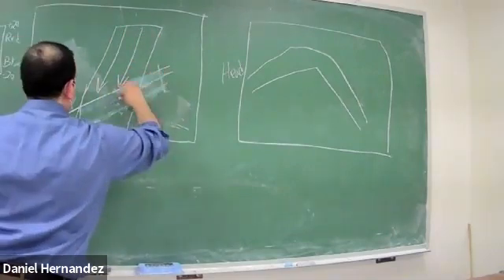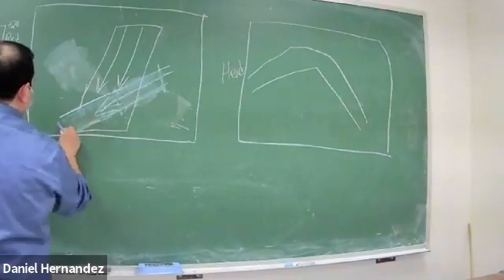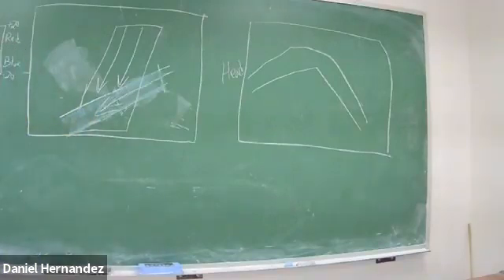The blood flow is still going this way, and it's still running away. So by steering, you're not going to necessarily change the color of that vessel. You have to look at what direction the blood flow is going, and whether it's coming away from or towards that ultrasound beam.